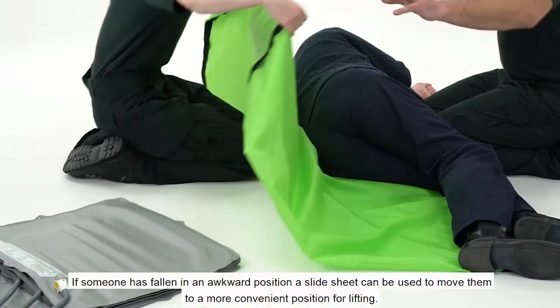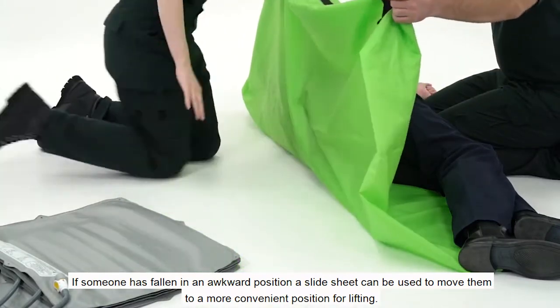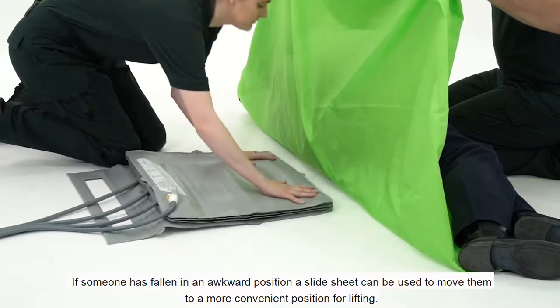If someone has fallen in an awkward position, a slide sheet can be used to move them to a more convenient position for lifting.